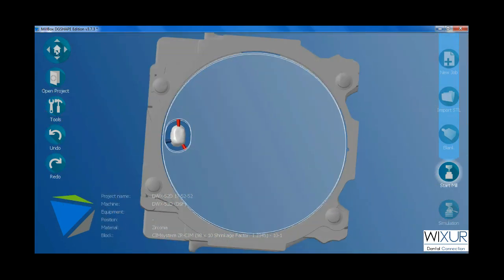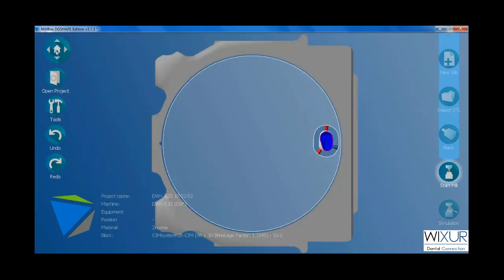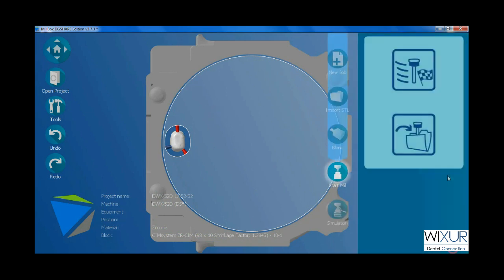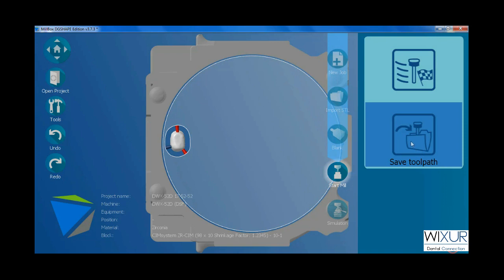Ok. I have nested the crown. Now I start calculation by clicking on start mill button and select save toolpath.